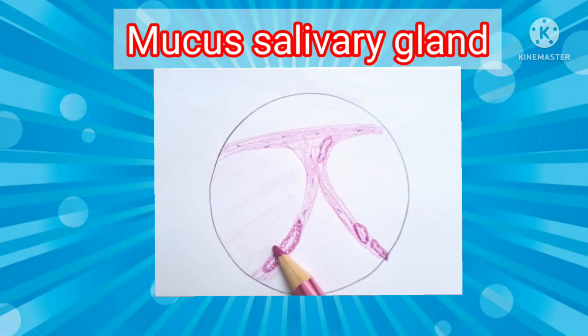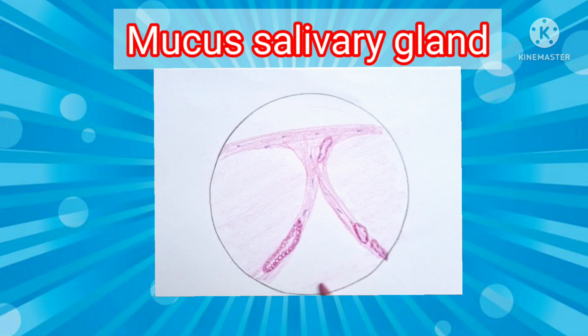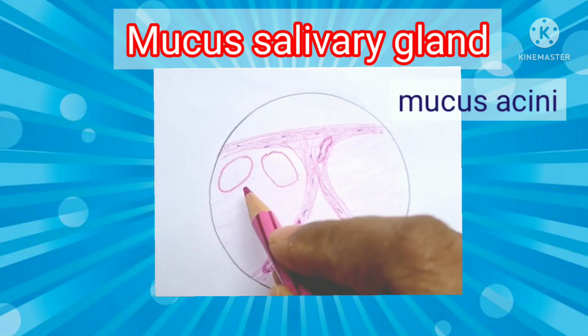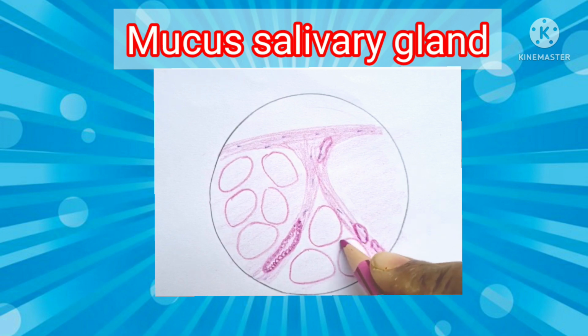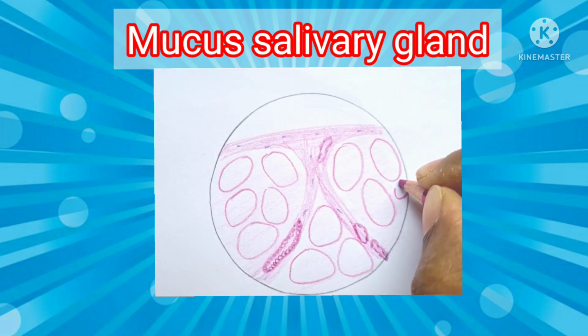In the mucous salivary gland, as we know, the acini are different. We have to draw mucous acini. Mucous acini are a little tubular and vary in shape and size, whereas serous were circular, no? Here they are very different in shape and size and a little bigger compared to serous acini.